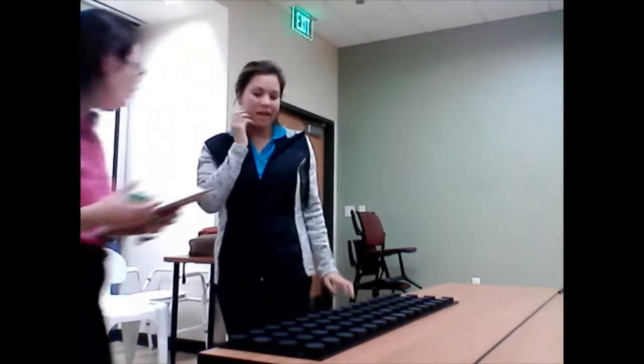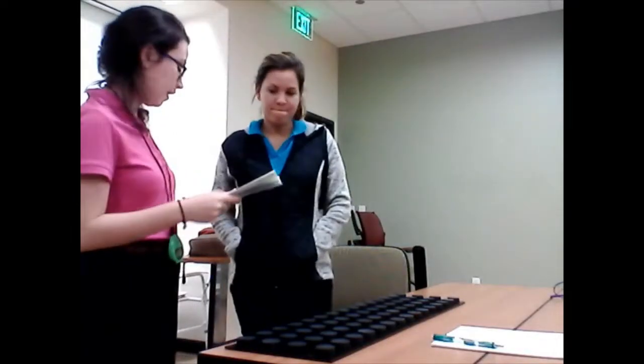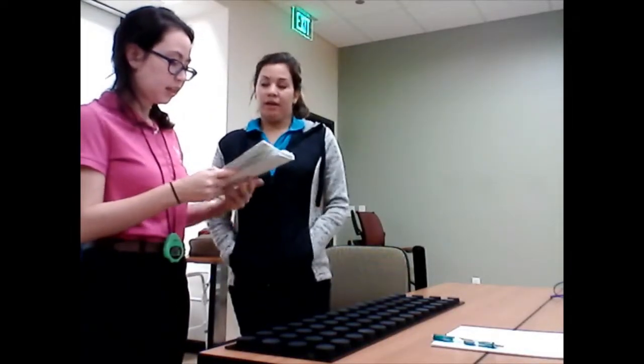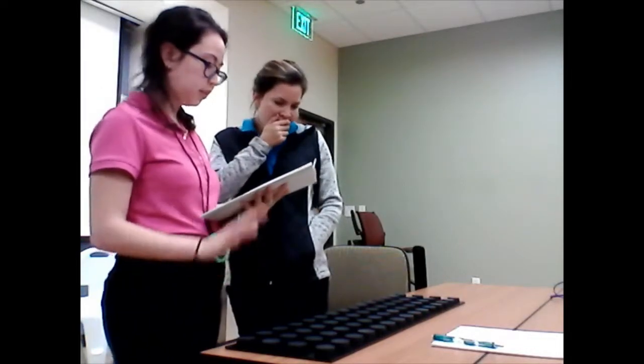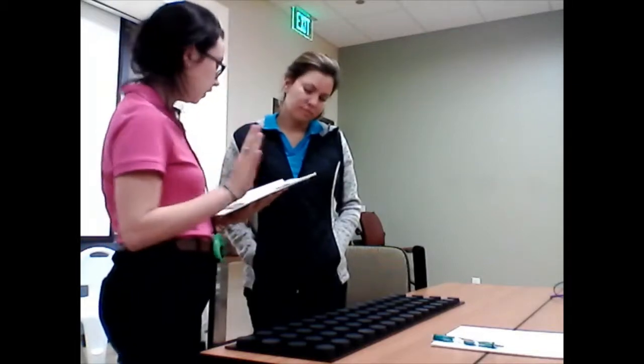Good job. That is all for this test, and now we're ready to begin a different test. We're now doing the turning test. This is the starting position for the test. The object is to see how fast you can turn the blocks over. You do it like this.